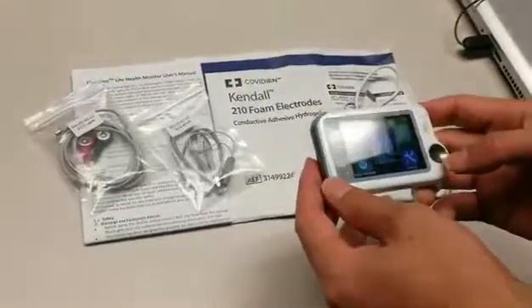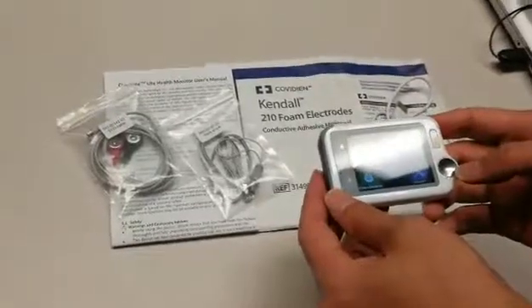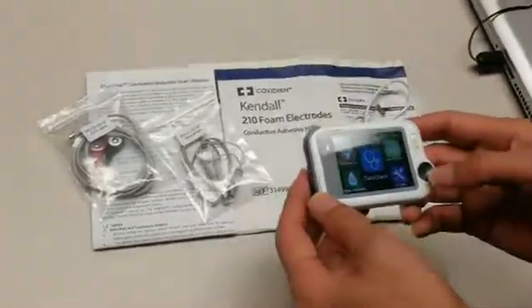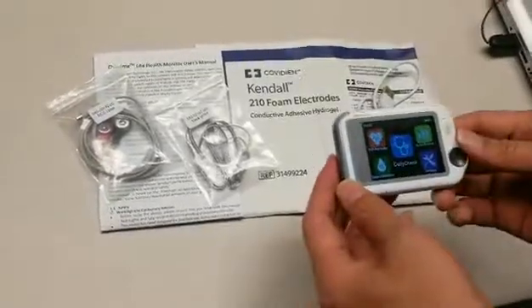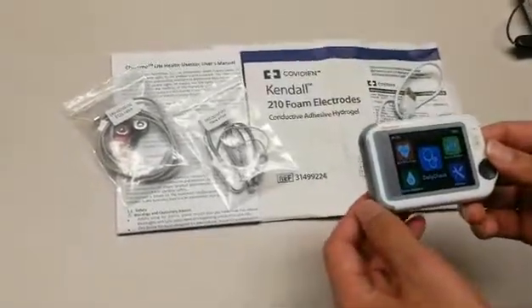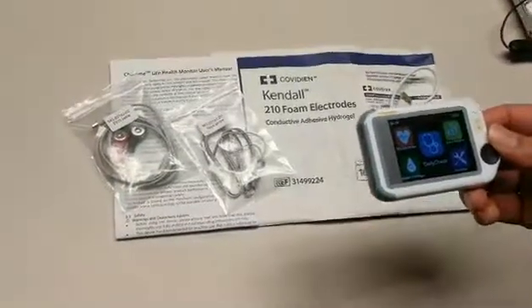Today we will be going over the FL50 vital signs monitor. What comes included with the item will be a pack of electrode pads, ECG cable, lanyard, user manual, and USB cable.